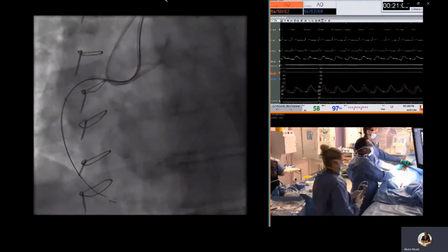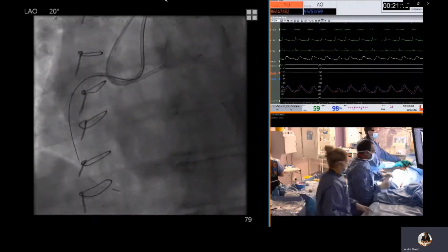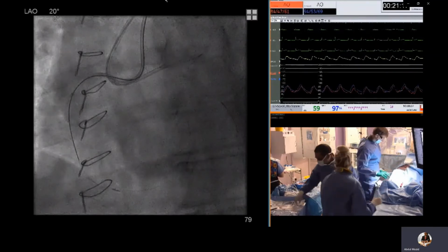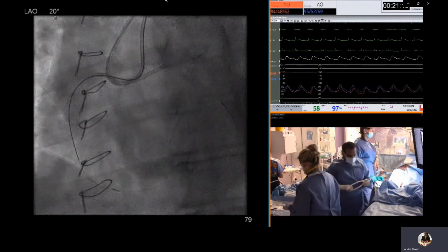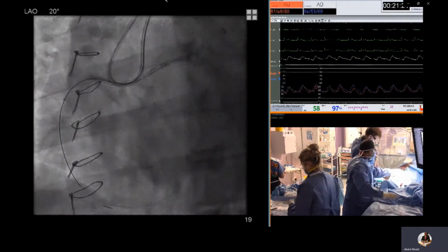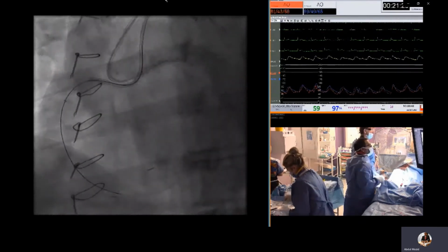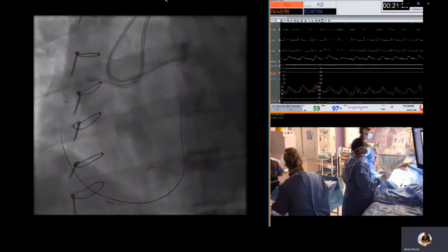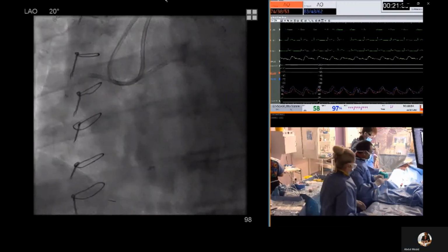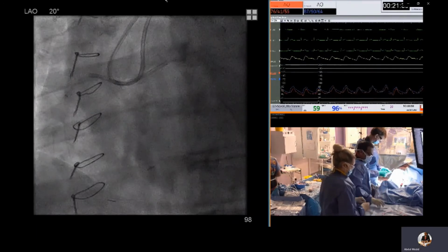Other approaches, once you have the retrograde microcatheter in the antegrade guide, are to perform tip-in maneuvers. And this could be particularly useful if it is not possible to externalize an RG3 due to tortuosity, which can occur particularly via a very tortuous retrograde channel.